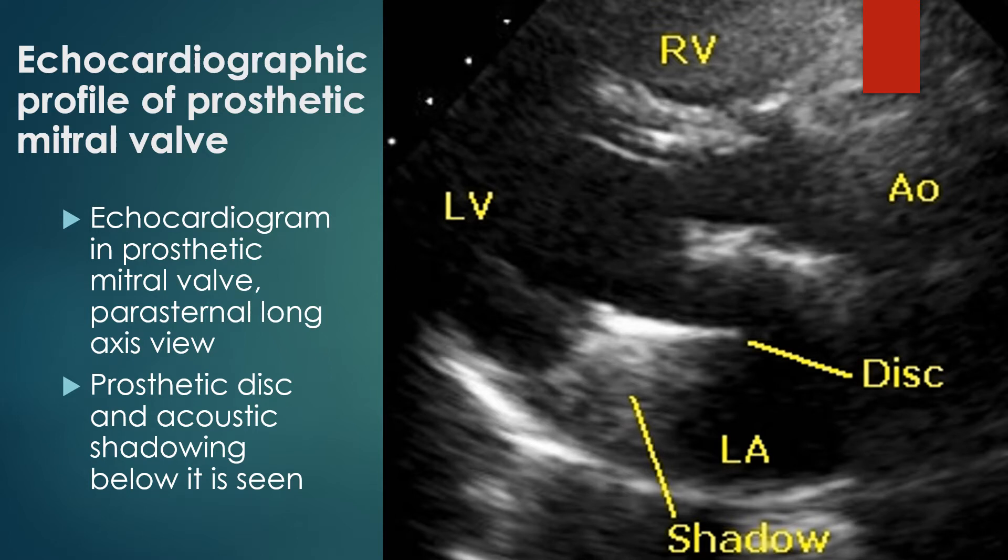The prosthetic mitral valve disc is seen in a horizontal position with significant echo density of the metallic component. Acoustic shadowing is seen posterior to the dense disc shadow, extending up to the posterior wall of the left atrium proximal to the mitral annulus. Because of this acoustic shadowing, it will be difficult to recognise any structure in that region, such as a vegetation or a thrombus.